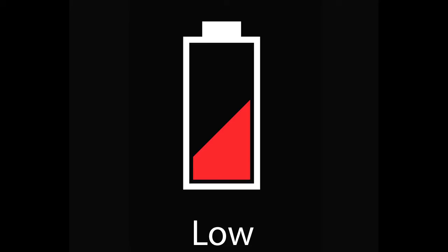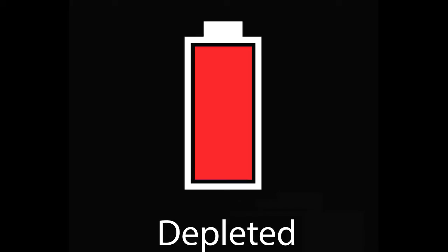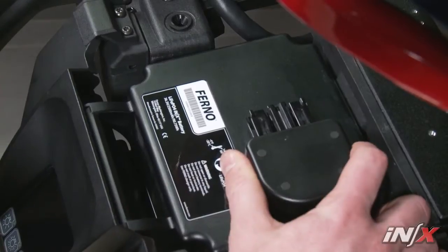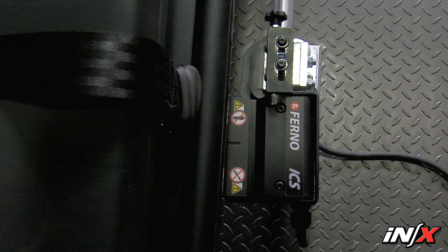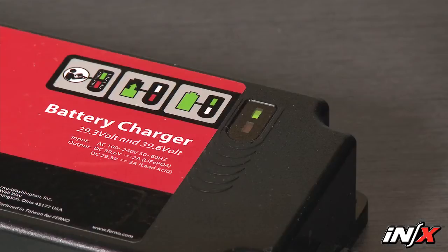Red indicates a low charge remains. When a low charge is present, one-third of the indicator will be steady red. If the icon is flashing between an empty battery outline and a full red battery, the charge is depleted. Exchange for a charged battery as soon as possible, or connect the battery to a power source such as the ICS or NX battery charger.